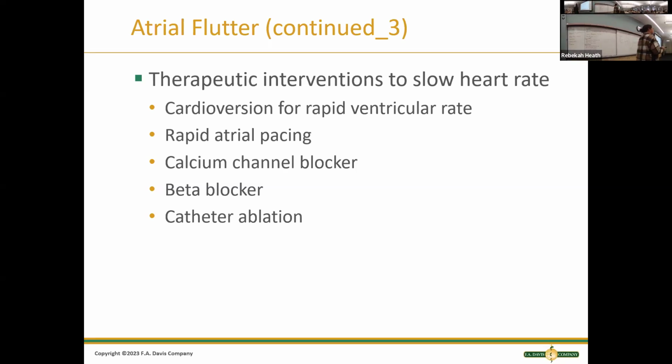Just like in the movies when they say clear, doof, when they charge somebody, right? That's a defibrillation. You all learned about defibrillation when you took basic life support. They talk about putting on an AED on somebody, and then the machine takes care of it. Cardioversion is a synchronized electrical signal that we send.